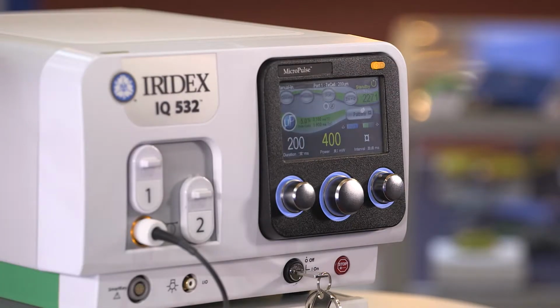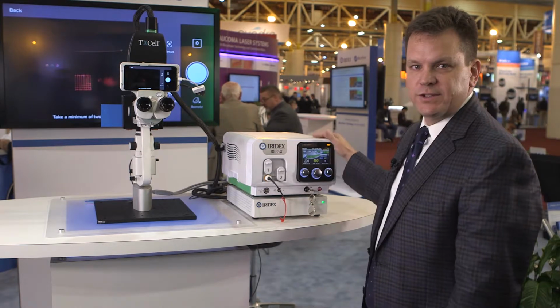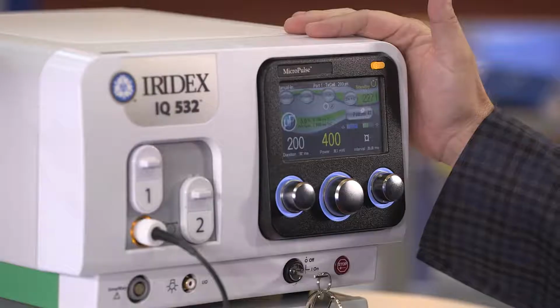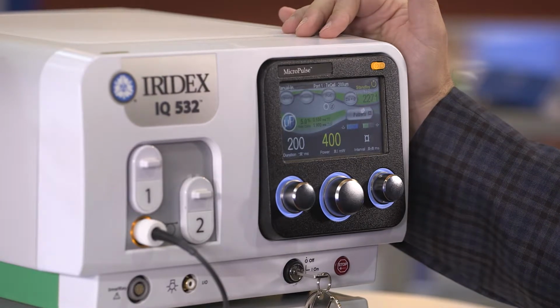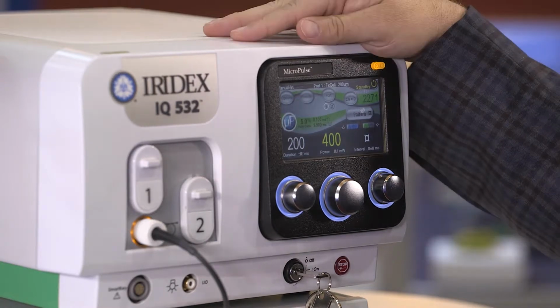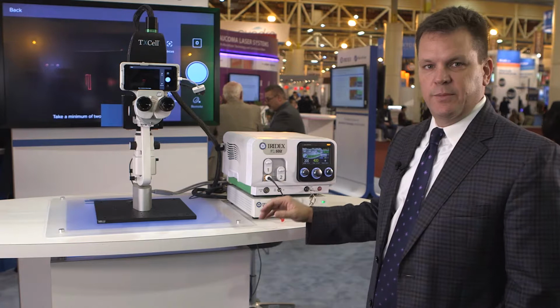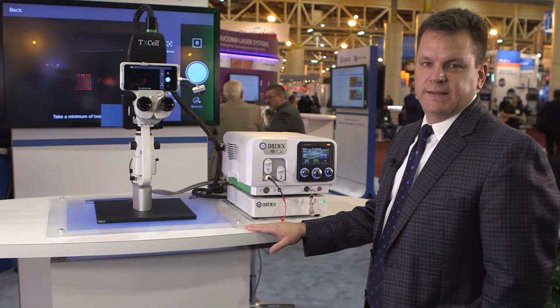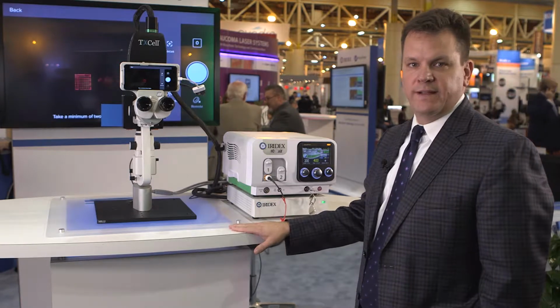Look at the laser and comparing MicroPulse technology versus continuous wave laser. We're going to put the laser in a continuous wave mode. Iridex's IQ532 visible green laser and IQ577 visible yellow laser have the capability of doing both continuous wave energy as well as MicroPulse energy. For the sake of this demo, we're going to compare those two different modes, continuous wave versus MicroPulse energy and their effects on the retina tissue.